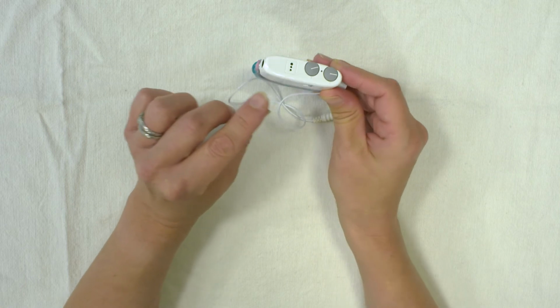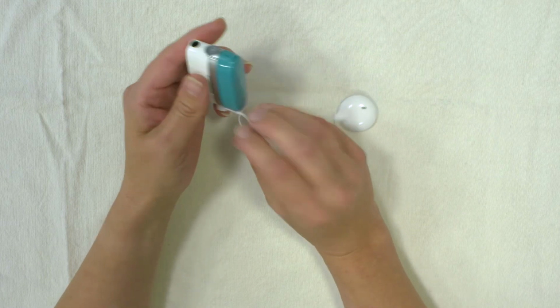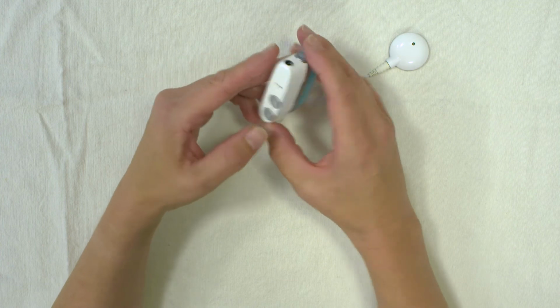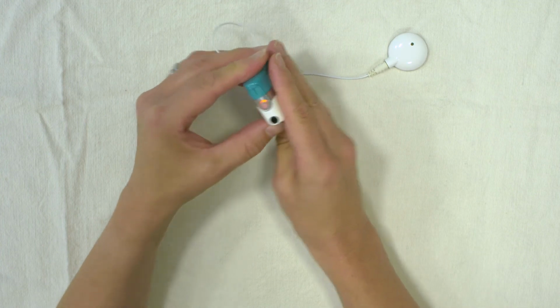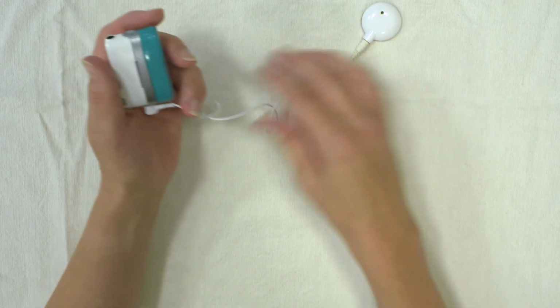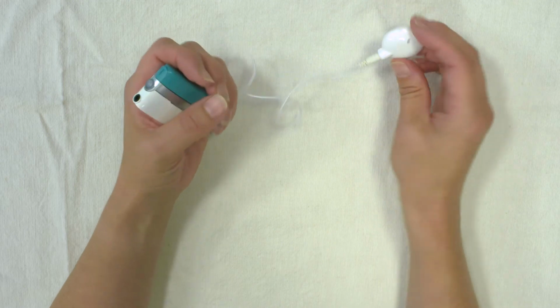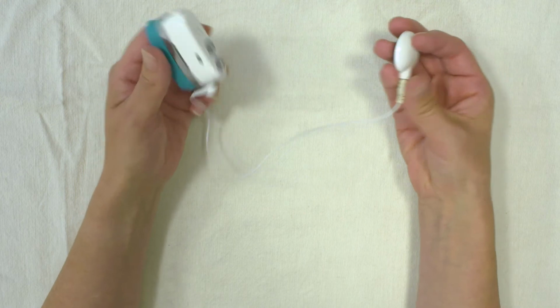On program 3, I've actually put the audible alarm on to demonstrate to you. For some children, it's useful to have an audio alarm. Just turn it off. The audio alarm works in the same way as the flashing red light. So it'll tell you if it's fallen off the head, lost connection, or there's a problem with the processor in some way.